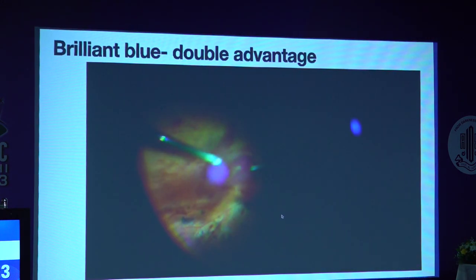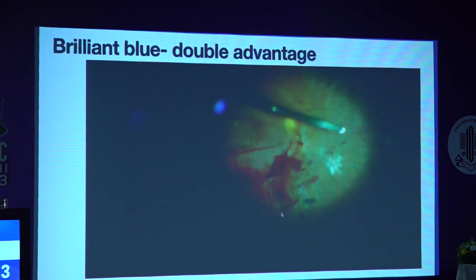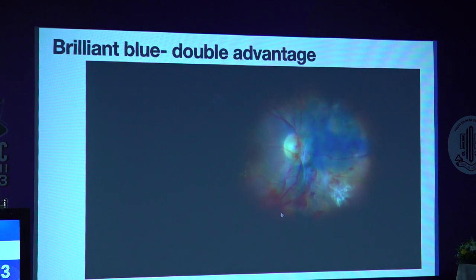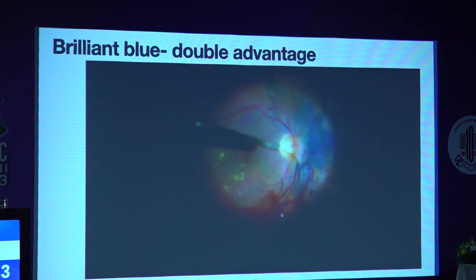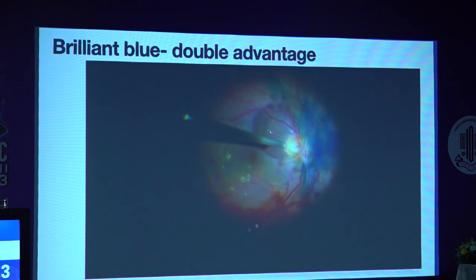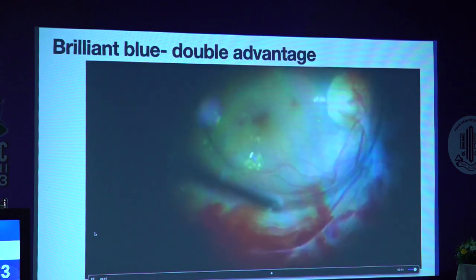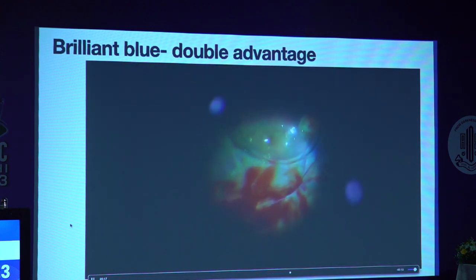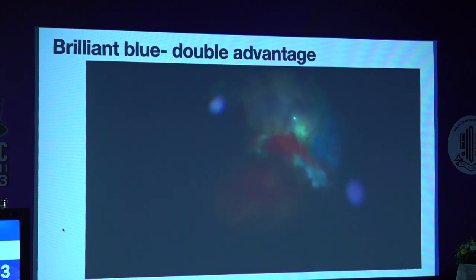And brilliant blue stains the ILM as well as the vitreous. So if you use it liberally during your surgery, it's also a good thing that can make your life easier instead of triamcinolone, because this stains the ILM as well, and so you have the double advantage with brilliant blue.